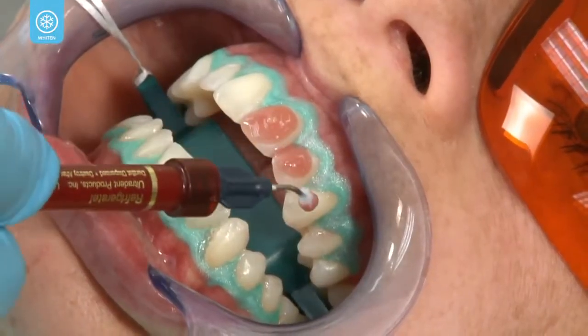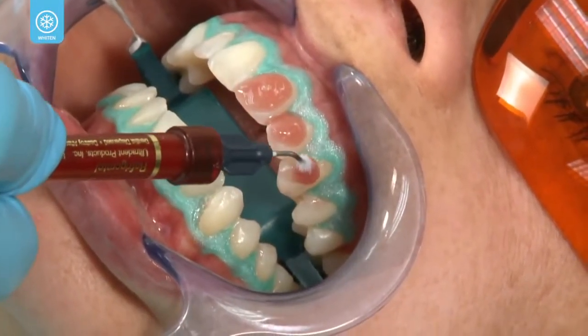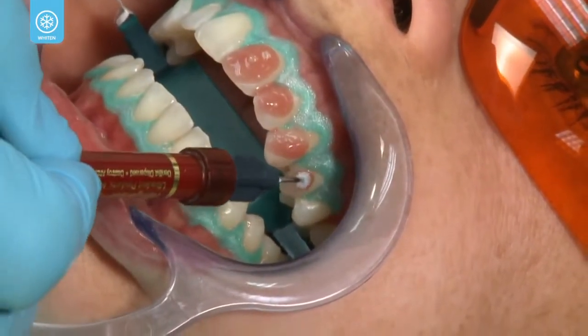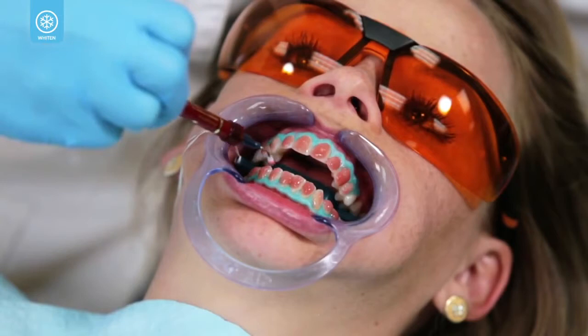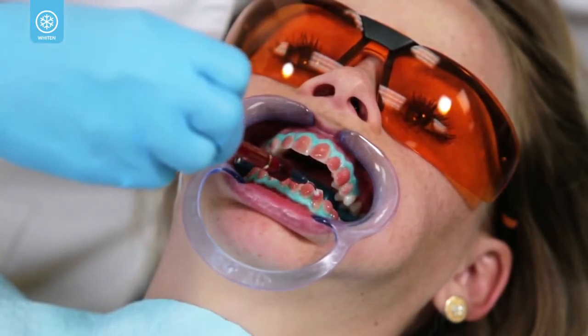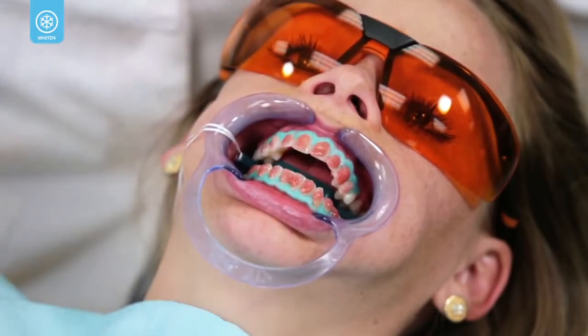Apply a layer of Opalescence Boost approximately 1 millimeter thick over the labial surface of the teeth to the incisal and occlusal surfaces. Allow the gel to remain on the teeth for 20 minutes, periodically checking and reapplying the gel to areas that have thinned or need replenishing.